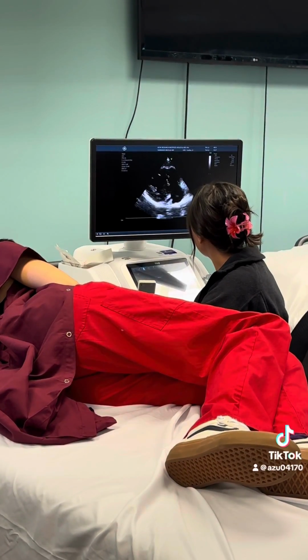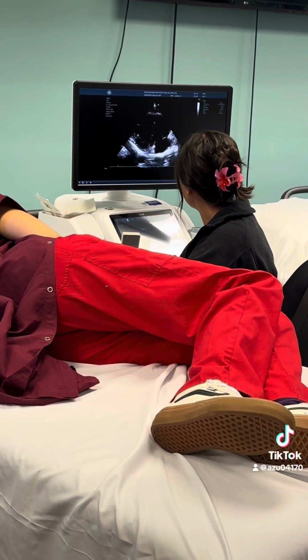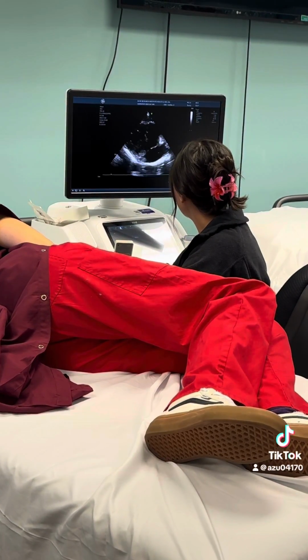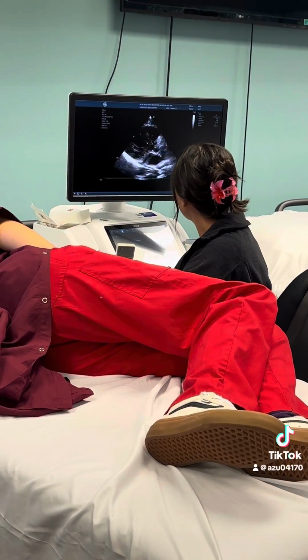In the next view, you would want to tilt inferiorly towards the patient's right hip to get the RVIT. In this view, we will get the right atrium, the tricuspid valve, and the right ventricle.